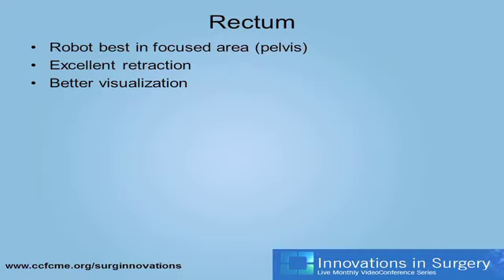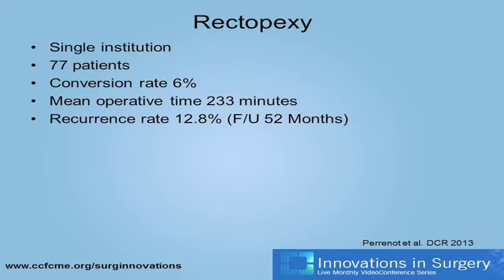The robot gives you, again, consistent retraction and much better visualization, and the two operations that really make sense when you're looking at the robot in the pelvis are benign disease such as rectopexy, and rectal cancer. For rectopexy, a number of studies have shown that it's safe and feasible. This is a study from a single institution that looked at 77 patients; the conversion rate is very acceptable, with a very acceptable recurrence rate of 12.8%, which is equivalent to any laparoscopic data, and that's actually long-term data. What about rectal cancer?